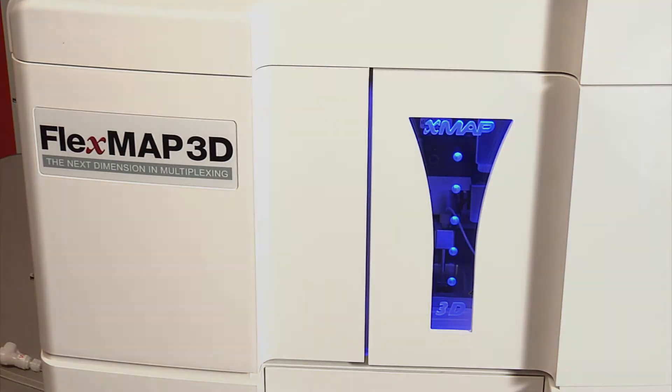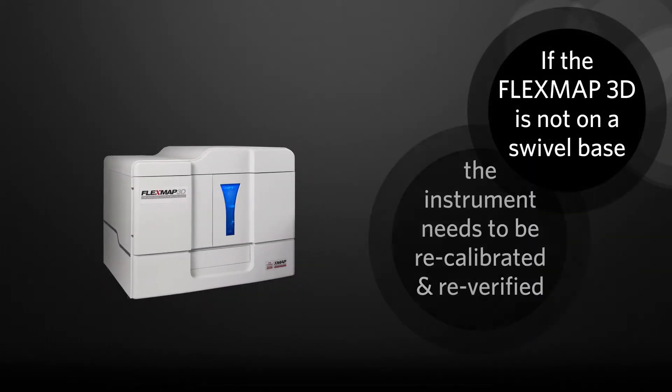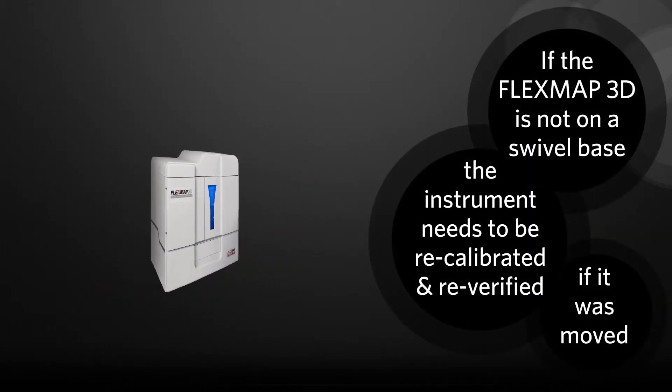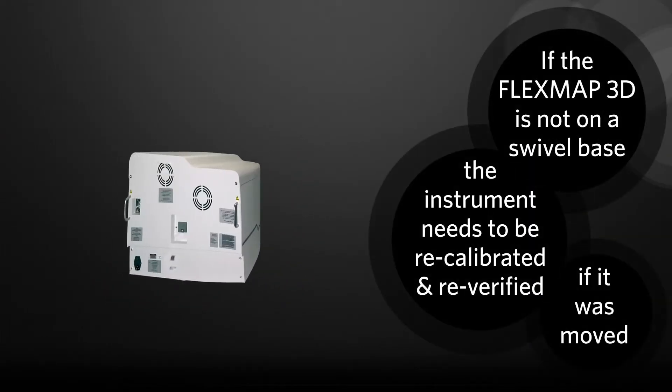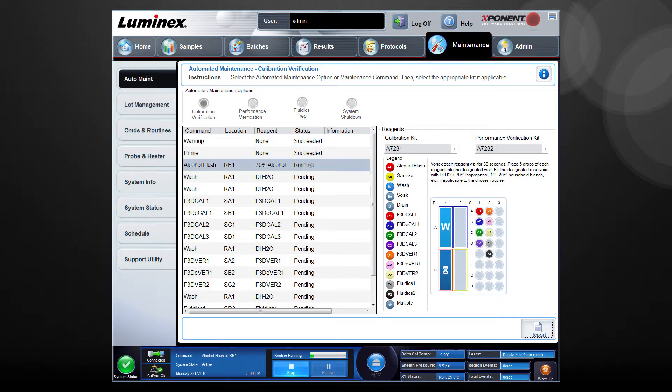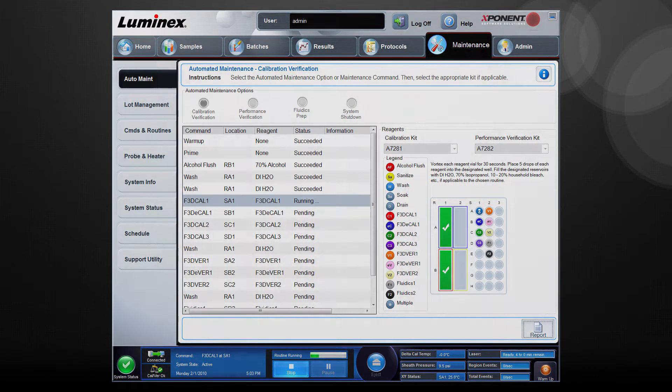Note, if the FlexMap 3D instrument is not on a swivel base and it requires moving in order for you to access the back of the instrument, use the software to recalibrate and re-verify the instrument after it is restored to its original location.